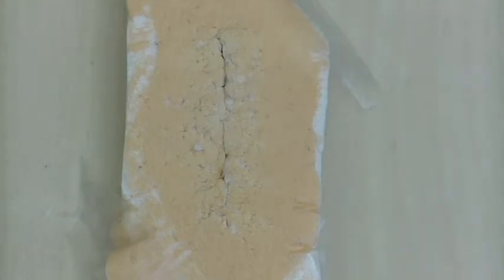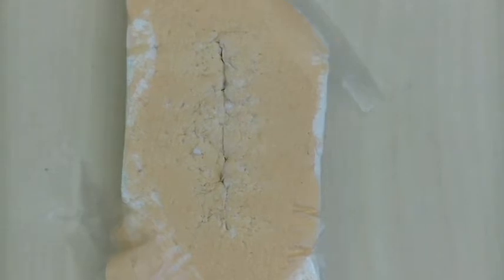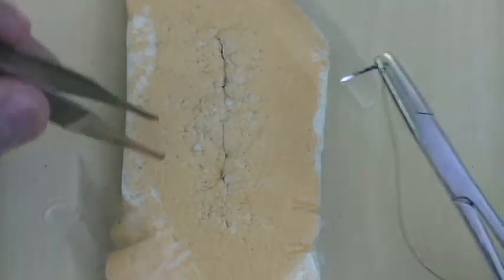A figure-of-eight stitch is a nice hemostatic stitch to stop bleeding. This may be used when suturing subcutaneous fat or when suturing on the uterus — it is often used to stop bleeding.